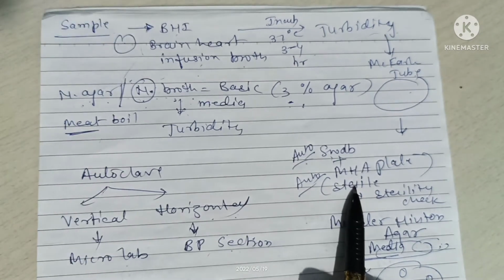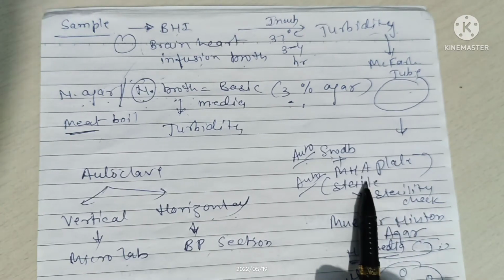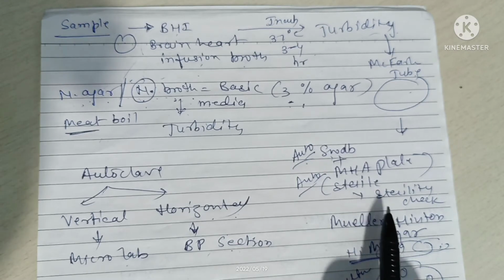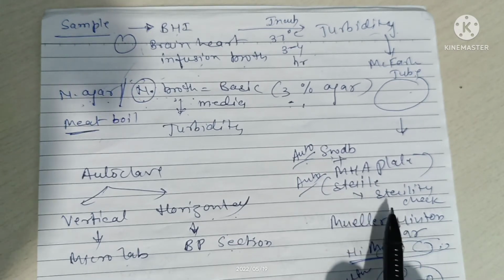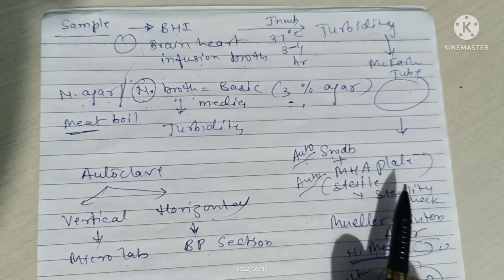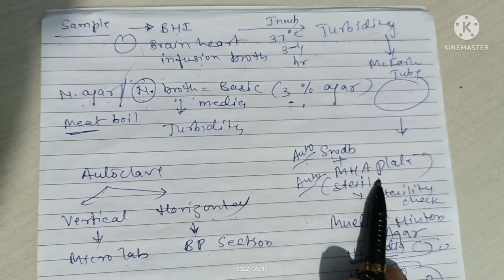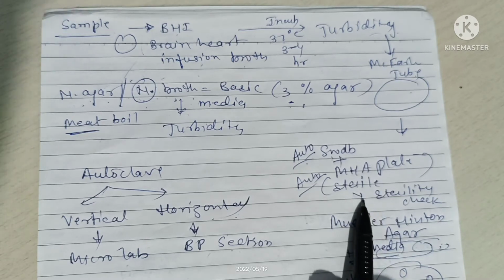The Muller-Hinton agar should be sterilized, and the sterility check is done by keeping these plates, after preparation, in the incubator for at least 12 hours.